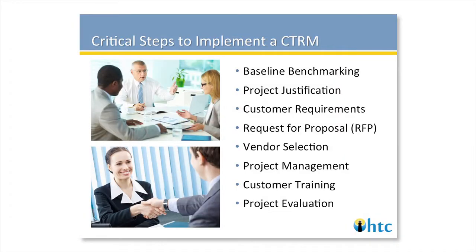I also want to talk just a little bit about the steps in implementing a CTRM system. What you want to do first is establish what's happening now. Pretty much every hospital that I talk with, they have some process for handling critical results. So you want to understand how are they handled now, what kind of a time frame is involved in handling those critical results. From that, you can then begin to look at what is the advantage of automating that process. And so you can begin to put together the justification for it.